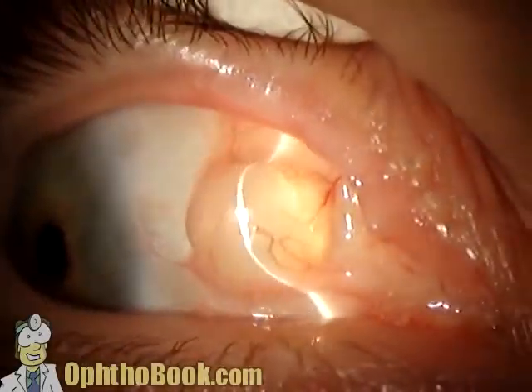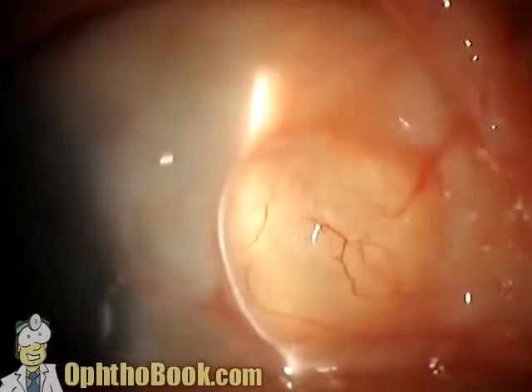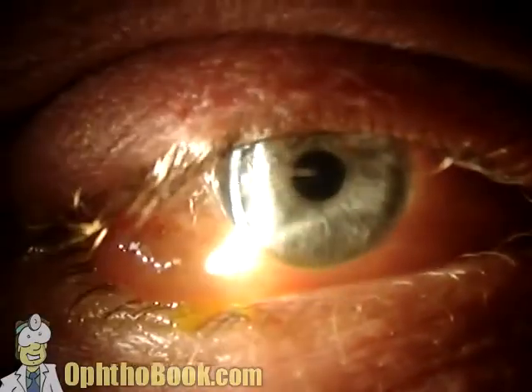It's benign because it's clear, and anytime you have something clear, you can always use your thin slit beam and get a good cross-section and gauge depth a little bit closer.